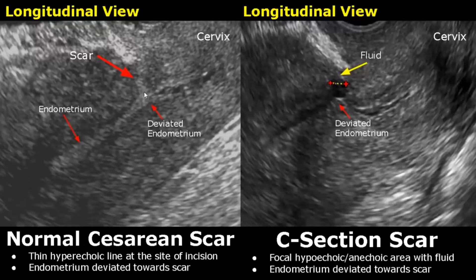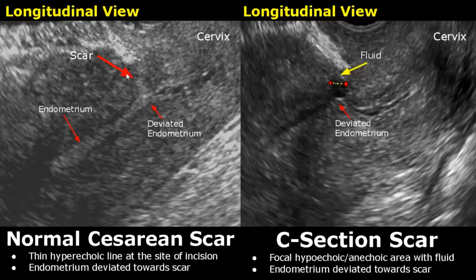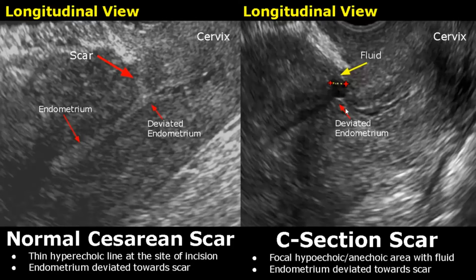Here is an image of a normal caesarean scar, which can appear as a hyperechoic line at the site of the incision in the myometrium. The endometrium will be deviated towards the scar. On the right side is another image of a C-section scar — there is a focal hypoechoic or anechoic area with some fluid and greater deviation of the endometrium.